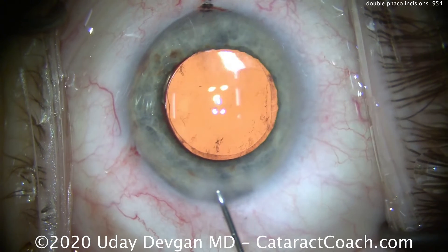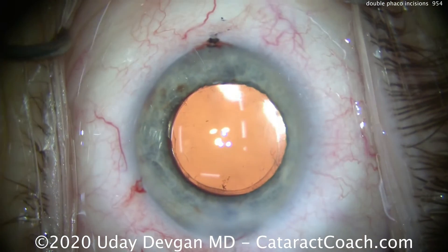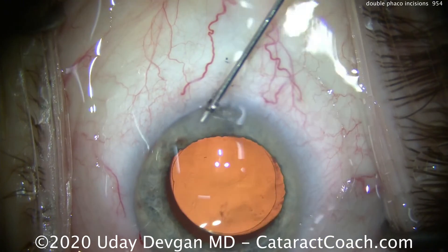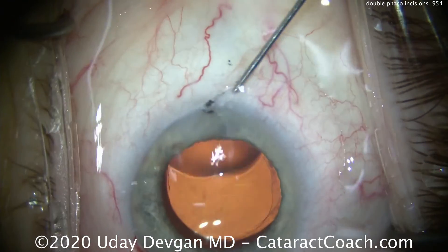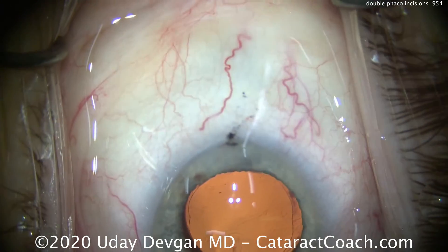Here at the end of the case, it's important to seal up these incisions. Remember, you have an extra incision, so you really have to take your time and make sure both incisions are well hydrated and sealed up completely so the eye is completely watertight. Having the patient look towards the side gives a little easier access.